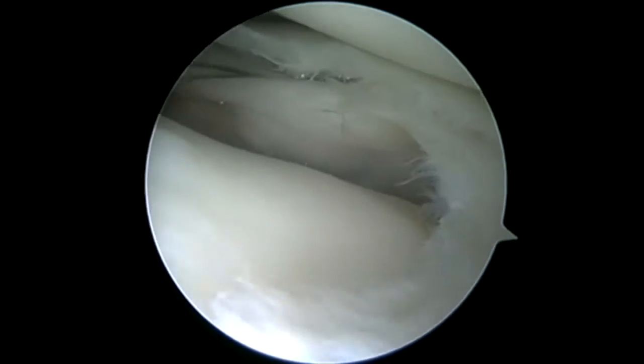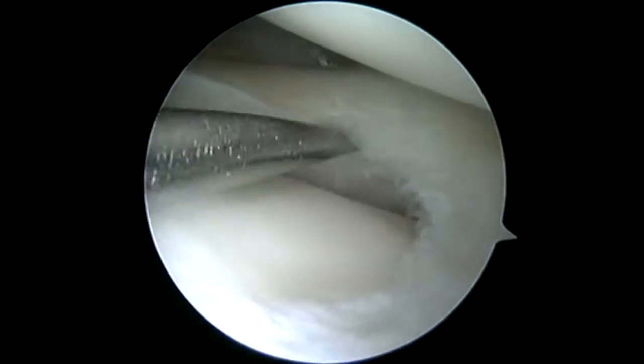Hi, this is Dr. Chris Doherty. We're going to go over a complicated revision meniscal repair utilizing a Nova Stitch Plus.